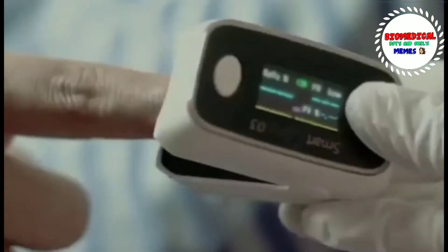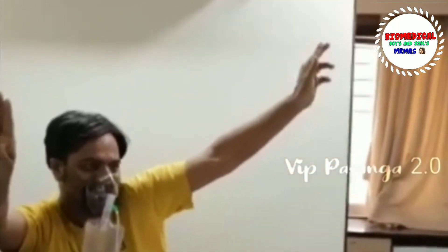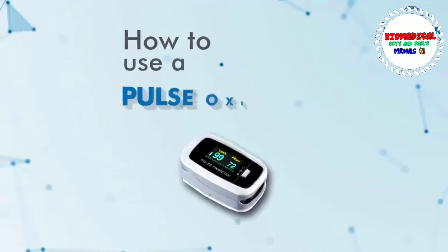What is it — like a tongue twister? It's a simple handheld device. We can measure the oxygen level. In this situation, this instrument is very useful. Let's talk about this.